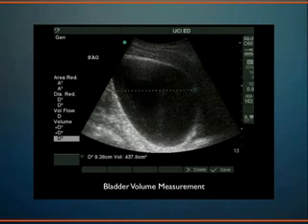Yes? When would you want to measure the bladder volume? Like why do you care about measuring the bladder volume? It's something that we want to know about actually quite frequently in the hospital, at all ages. In little babies who have a fever, we want to check their bladder. We want to basically cannulate their bladder, put a catheter in their bladder to get the urine out, to send it off for urine culture. Well, some of them just urinated in their diaper, and you would unnecessarily put them through the procedure of a bladder catheterization, which is painful. So you have to wait until the bladder fills up, basically. So I train my nurses to do this, and they take a peek at the bladder before they bother putting a catheter into a small child.